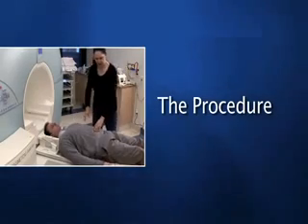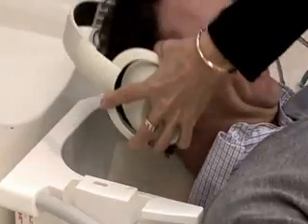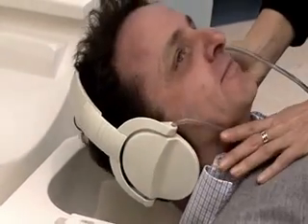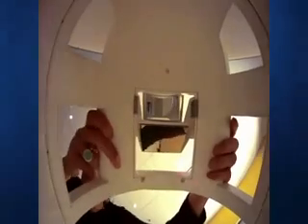This is a questionnaire that we have our patients fill out. Now it's very important that you answer these accurately. Each fMRI procedure takes on average 45 minutes to complete, which can be a long time in such a constricted space.